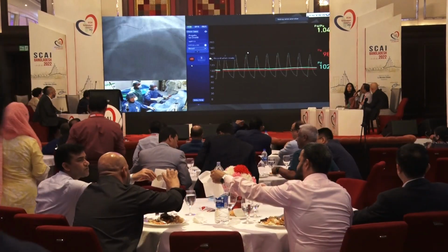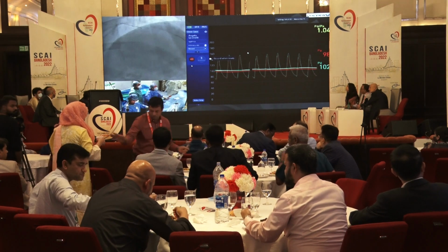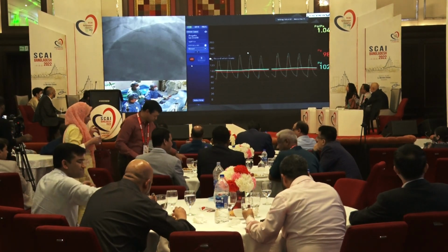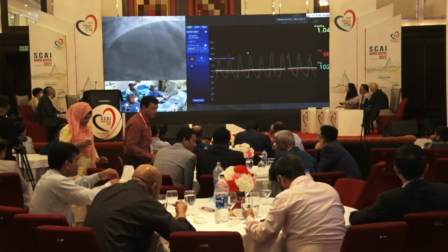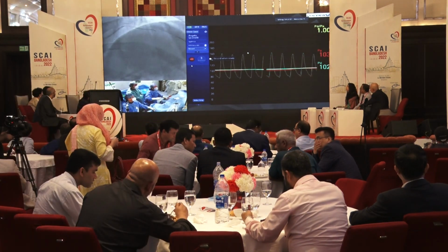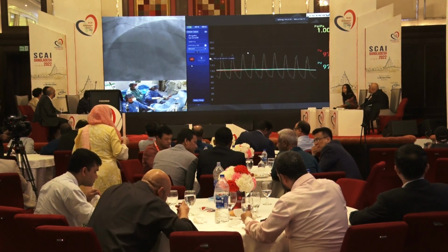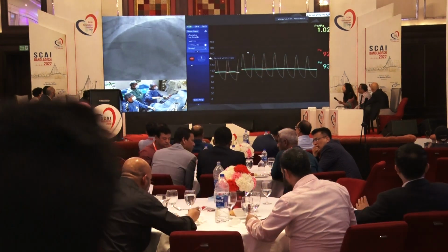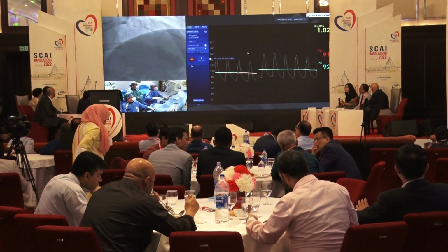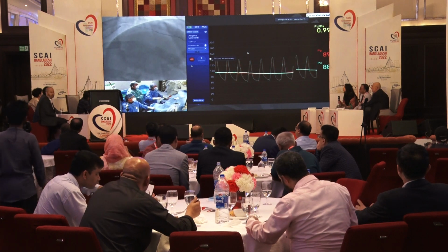I prefer not to inject any dye, otherwise I change my calibration. Are you doing FFR or using adenosine? It was not an FFR. We did not inject the adenosine. It was only the baseline Pd/Pa, which is not obviously validated for evaluating critical stenosis, but anyway, it was borderline critical even for FFR values. So we decided, if you want, we can do DFR.